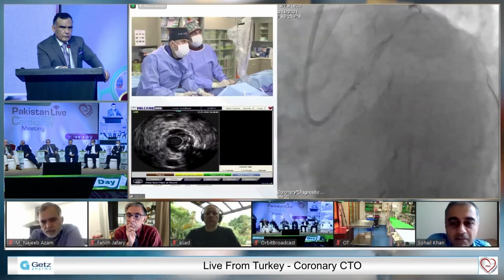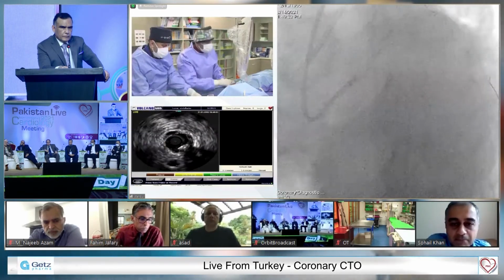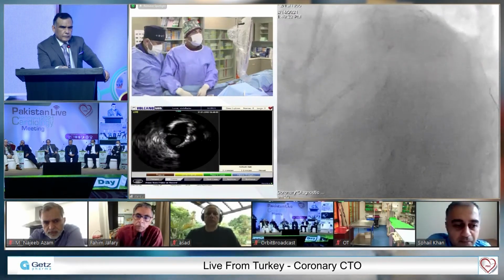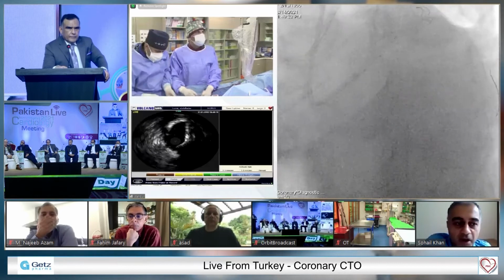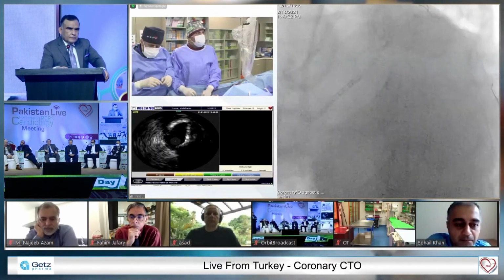So you see, I am just at the occlusion, right? Yeah, here a little bit pull back. So I'm 100% sure that level is your level. And which wire are you going to try and penetrate with? I think, yeah, I can try.